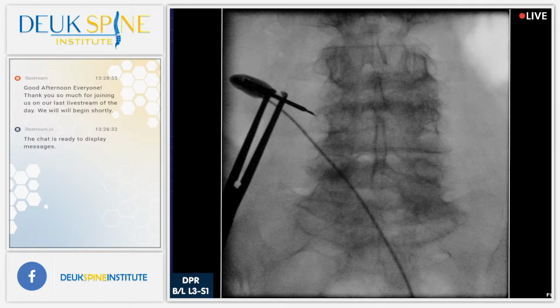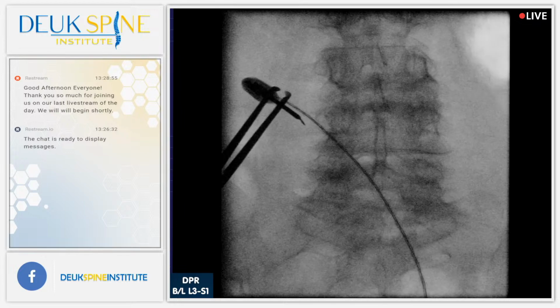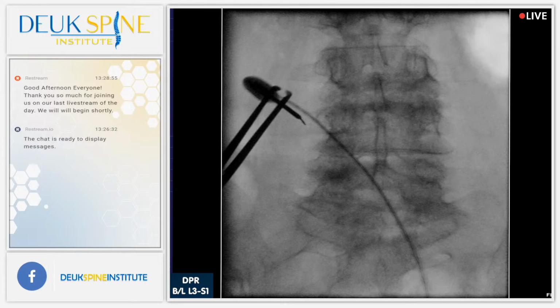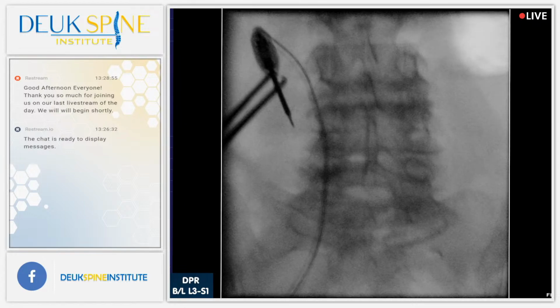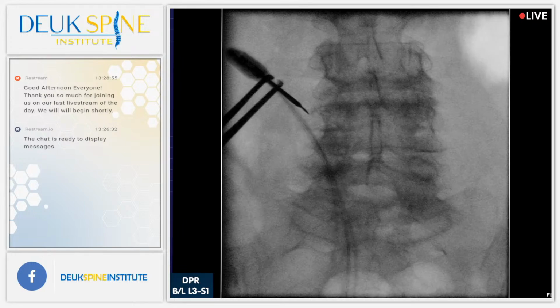That's really good right there. I can make it stay. Nope, see, it's already moved. A lot of the movement is due to the patient's muscles twitching. How's she doing? That seemed to be a little bit better, right?